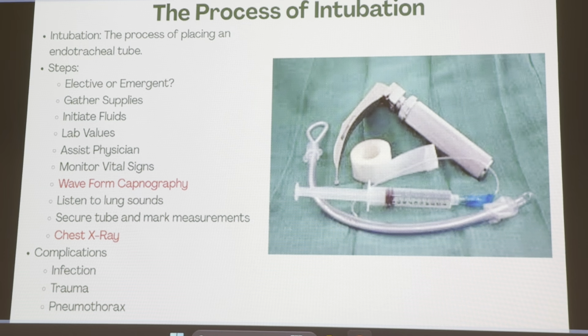It's gonna get real tight, real taut, and you'll see that because there's so much air that we're introducing into that gastric space. With that, we gotta think about nausea, vomiting, potential aspiration risk because we're introducing so much air into that as well. Listen to those lung sounds. What if I don't hear any lung sounds on the left side, but only on the right side?